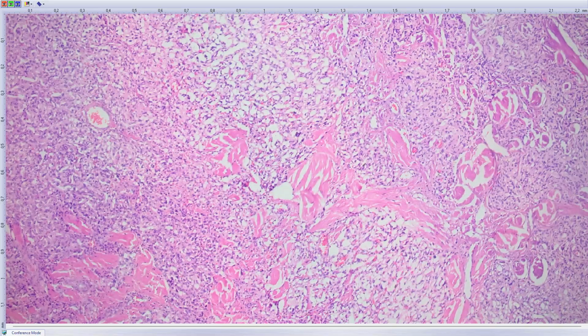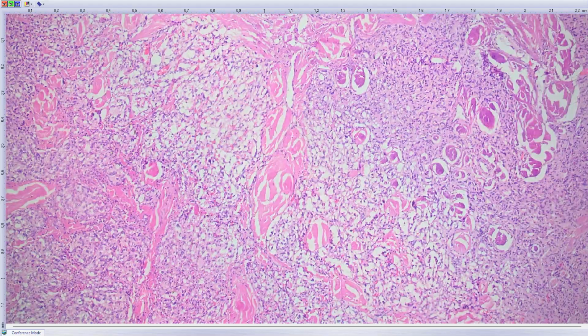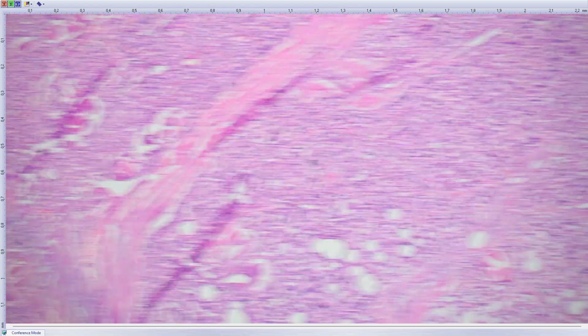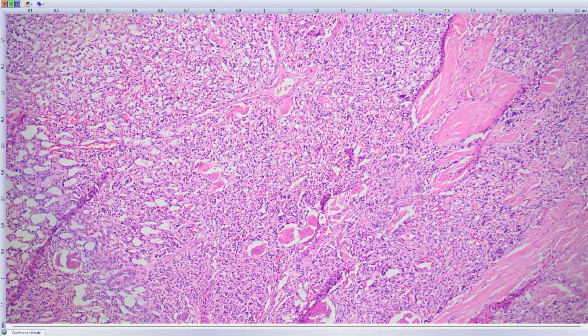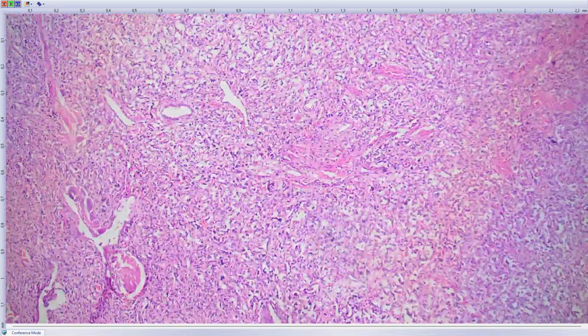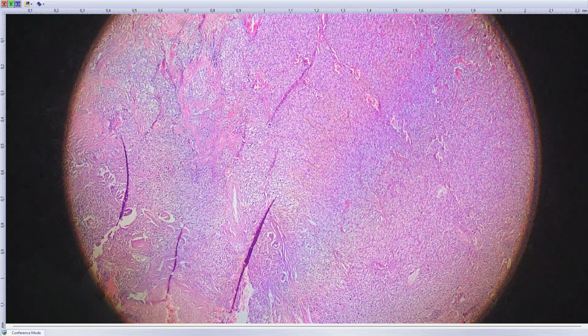The biopsy is not nice, because they baked it with current, so these are all artifacts caused by the warm knife, and the reason is the region is bleeding.